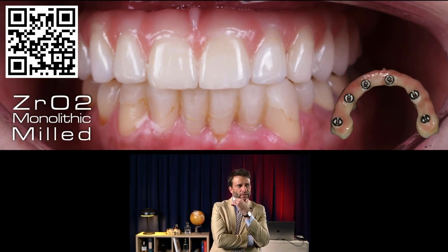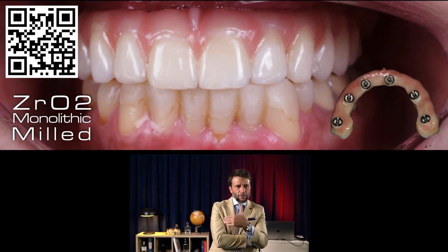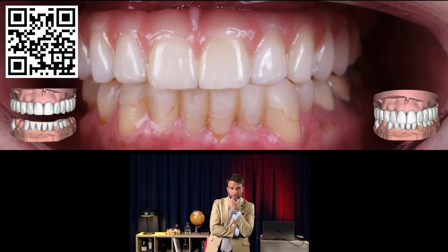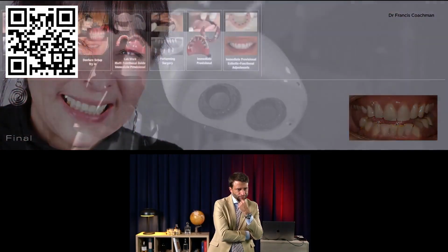So the composites on the bottom, they did their job of creating this bite, this provisional transitional phase, and you can now move the lowers into ceramics as well if you wish. Or new composites, as you wish. And this is the final smile.